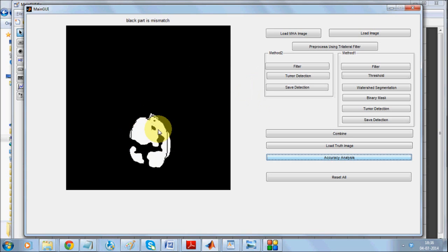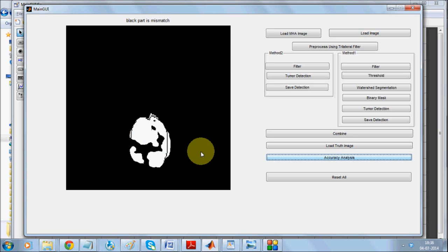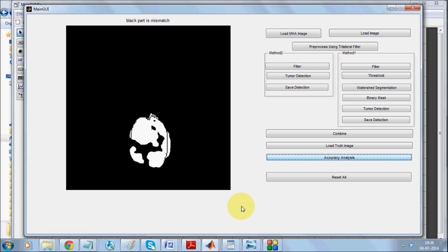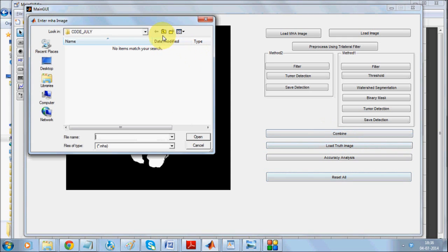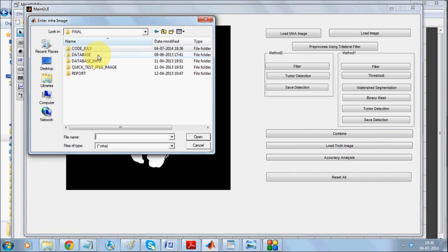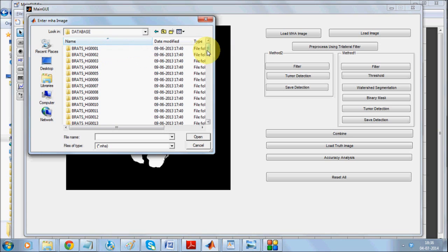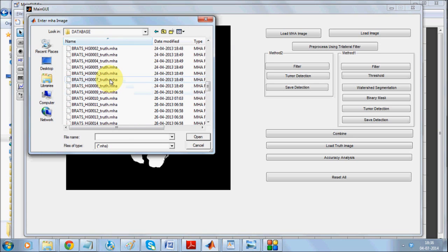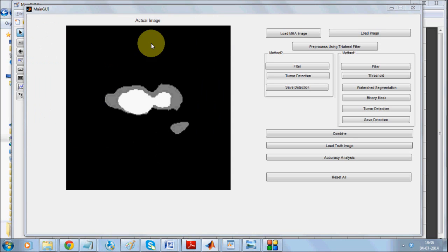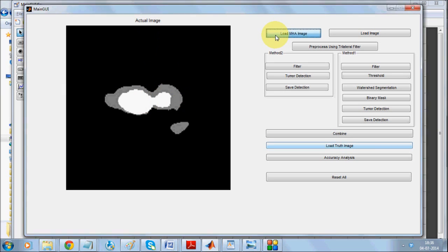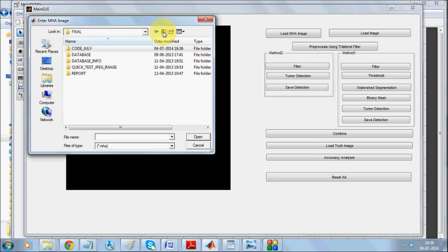All the black part is the mismatch. Now I can just load different truth images to see what kind of tumor challenge is present. It's the seventh one. Let us load the seventh image.